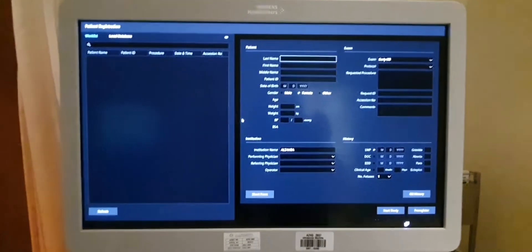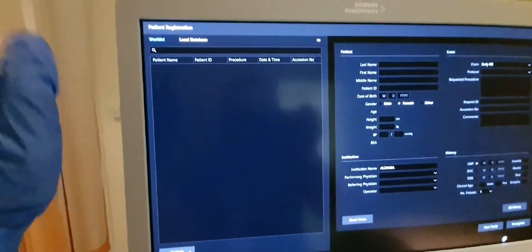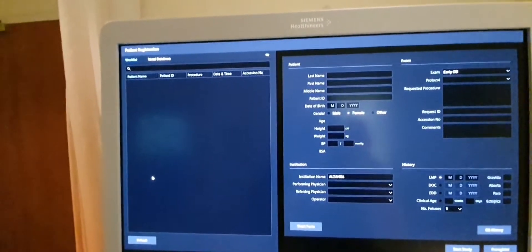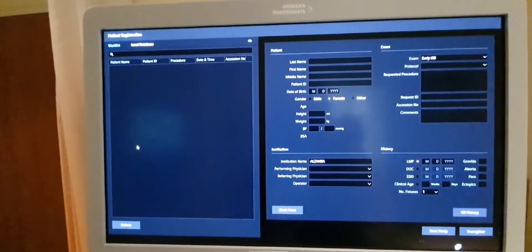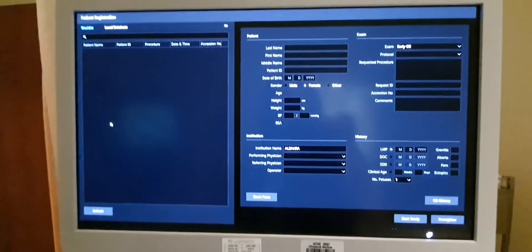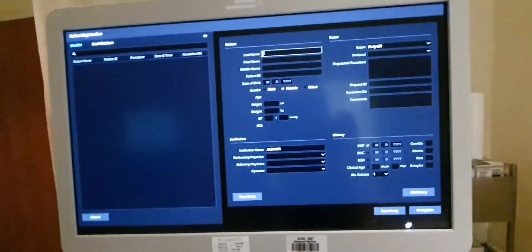If there's a patient, you just need to select the patient and it will show up — you may need to refresh. I don't have a patient at the moment so there are no details here, but usually the patient name, patient ID, procedure date and time, and accession number will appear. You just need to select the correct patient, but first you need to ask the patient their complete name and date of birth to verify you have the right patient.